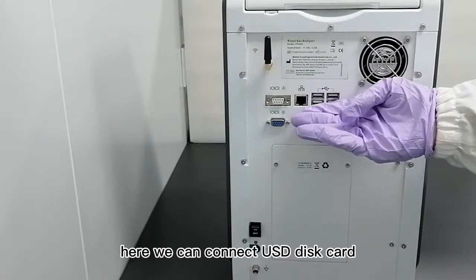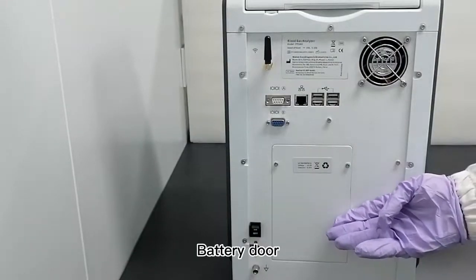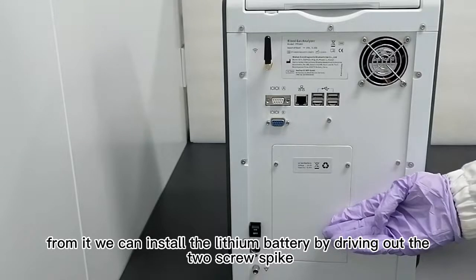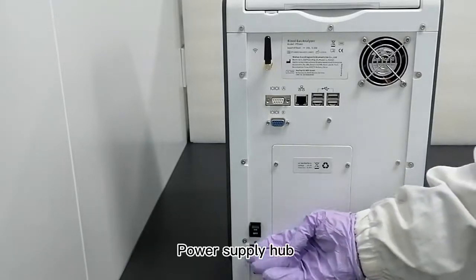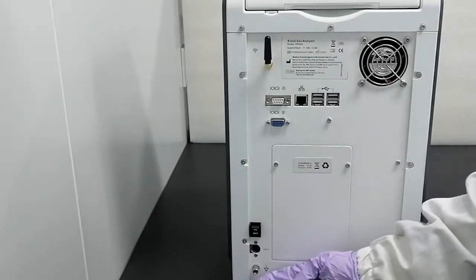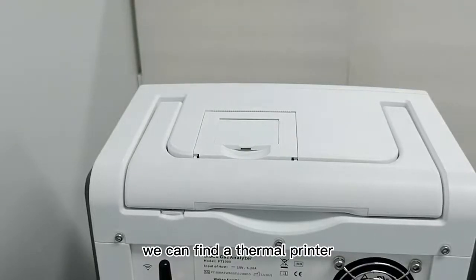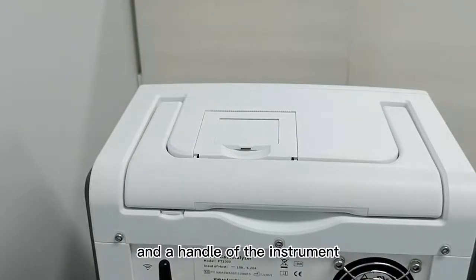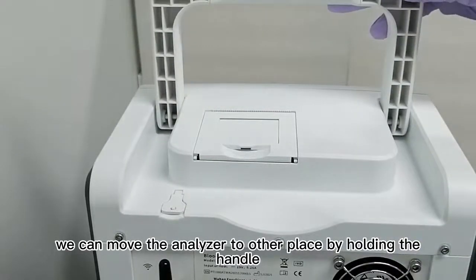Also on the back panel are USB, network, and IO port connections, where we can connect a USB disk, network cable, computer, and so on. There is also a battery door — from it we can install the lithium battery by driving out the two screws. The power supply hub and protective earth are also located here. On the top of the Analyzer, we can find a thermal printer and a handle for the instrument, allowing us to move the Analyzer by holding the handle.